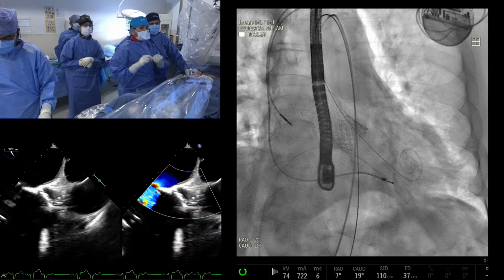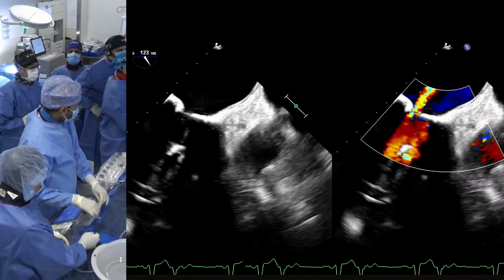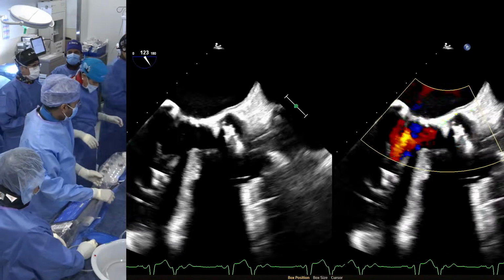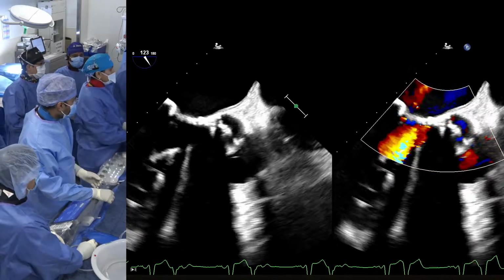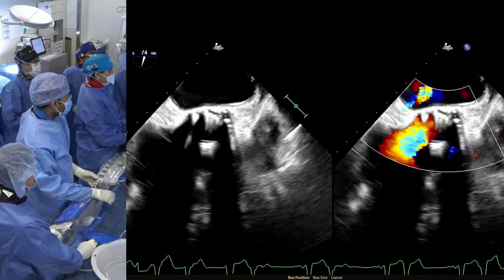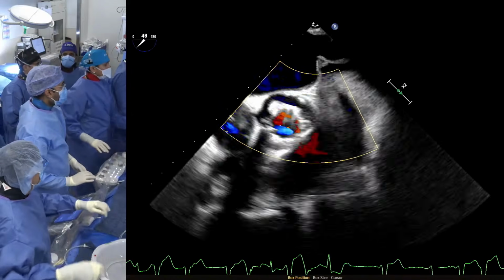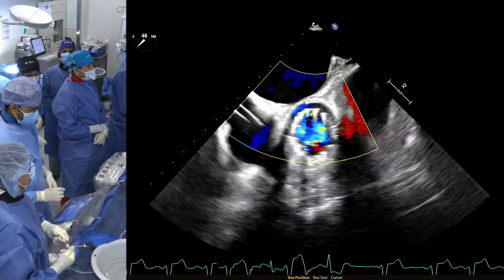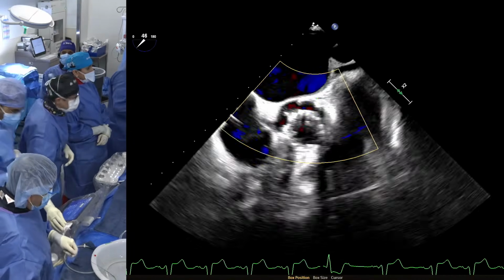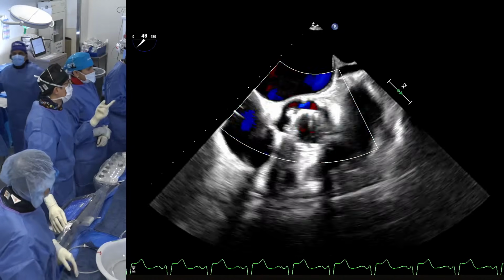Stan, what are your initial thoughts in terms of the severity? Show your short axis, Stan, where you did all those area measurements. And continue to show the hemodynamics also. Definitely much better. Much better for sure. Also, fluoroscopically, it looks better.